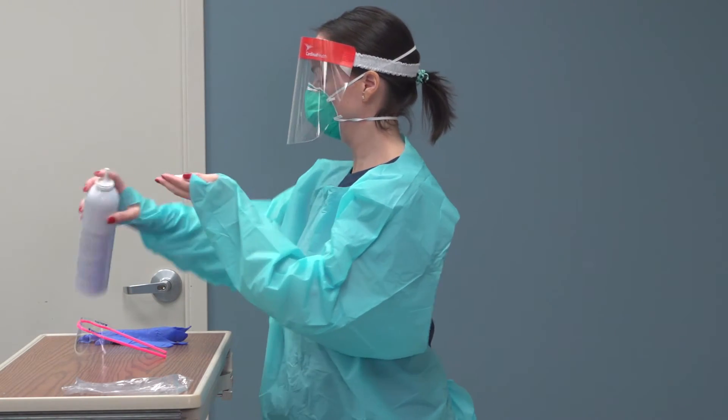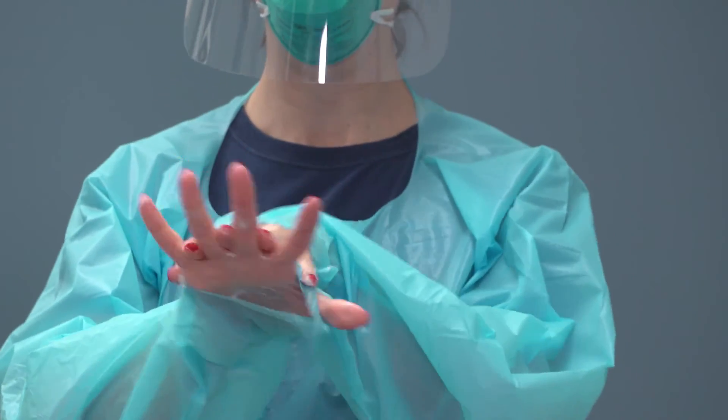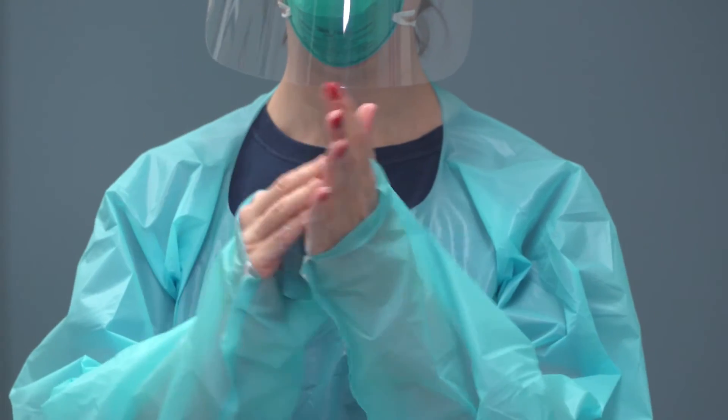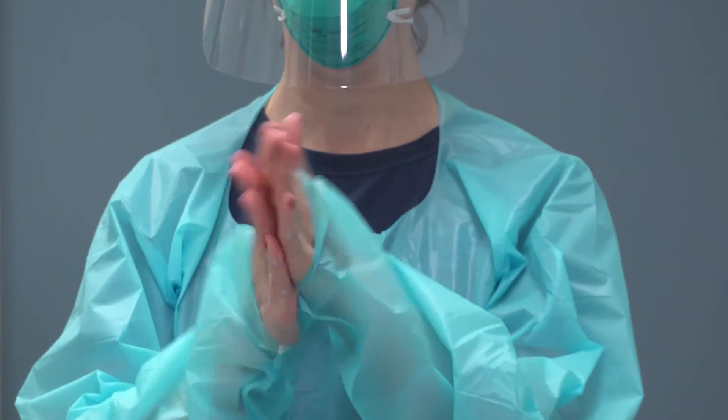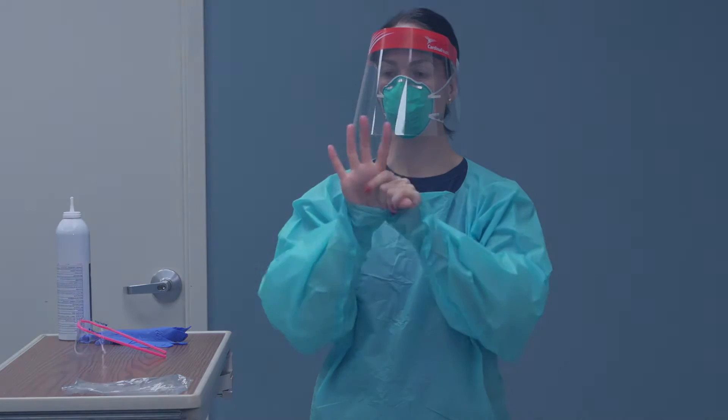Hand hygiene is important prior to the donning process so we can ensure a clean process for application of all personal protective equipment. The second hand hygiene is important prior to putting gloves on for foaming in for entry to the room, in case any contact was made during the application process.